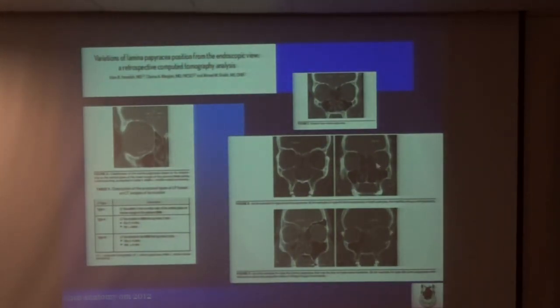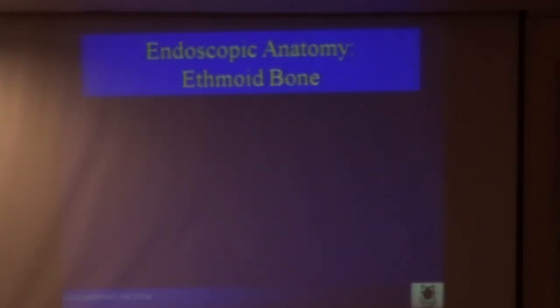This is when it's lying medial, and this is something you have to be alert to. You can easily get into the lamina papyracea and have a complication. And then type 3 is when it's lateral and away from you. In this case, you have to dig a little bit more along the lamina papyracea to get these fungal balls out or get the sinusitis out. So I find this very important. We can explain it more while we go through.